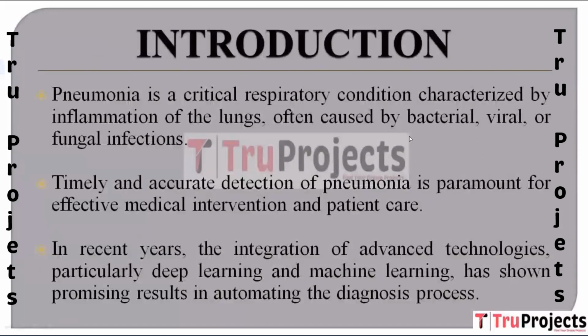So now coming to the introduction part. Pneumonia represents a severe respiratory ailment marked by lung inflammation, frequently instigated by bacterial, viral or fungal agents. The prompt and precise identification of pneumonia holds utmost importance for efficient medical intervention and optimal patient treatment. In the modern era, the incorporation of cutting-edge technologies, notably deep learning and machine learning, has exhibited encouraging outcomes in streamlining the diagnostic procedure.